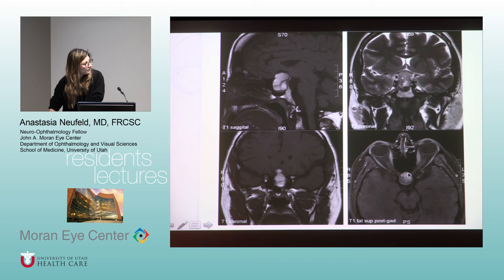Yeah. Just a quick question. Just to remind me, this is so big anatomically. This is a left junctional defect, correct? So she's compressing her left optic nerve. Right. Okay. Right. And so you just have to always think about a chiasm with the junctional.